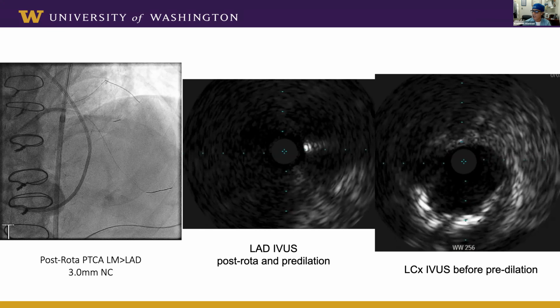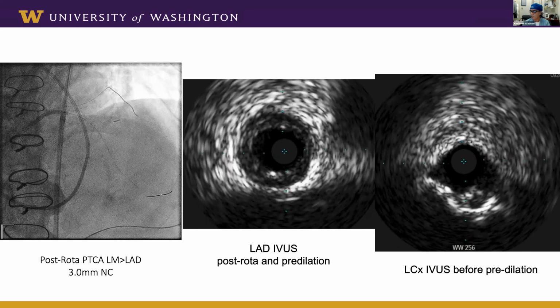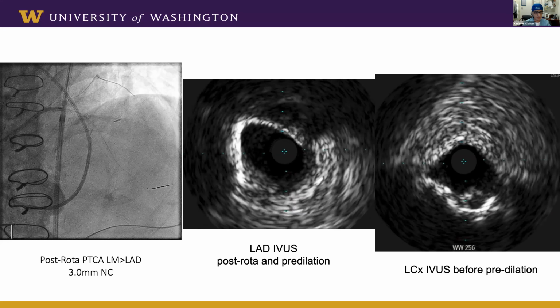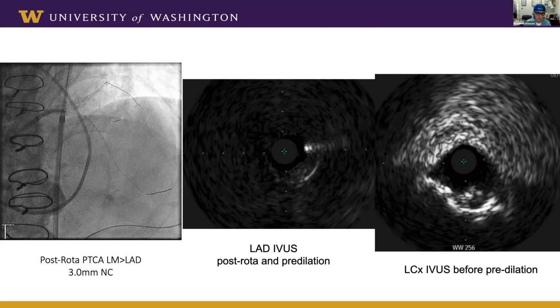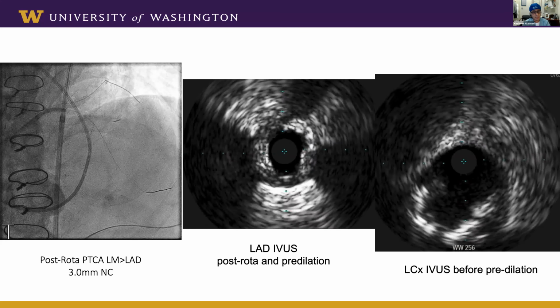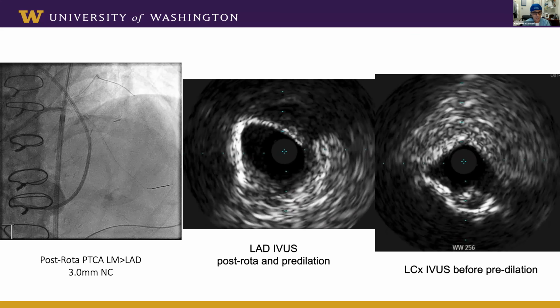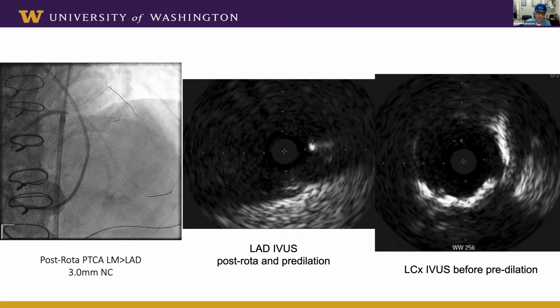Instead of, we were thinking culotte, and Dr. Nayal Borges had a nice comment here. He said, I will exclude crush. And I agree with him. Knowing the short left main, you're really not going to do a crush. It either is going to have to be a TAP or a modified, really minimum culotte, which is my preference. But my preference now, especially after the EBC trial, is actually a single stent strategy. That was actually my initial approach to every left main: if I could get away with a single stent strategy, that's what I would do. And now, single stent strategy here is very viable, knowing the imaging told us that.